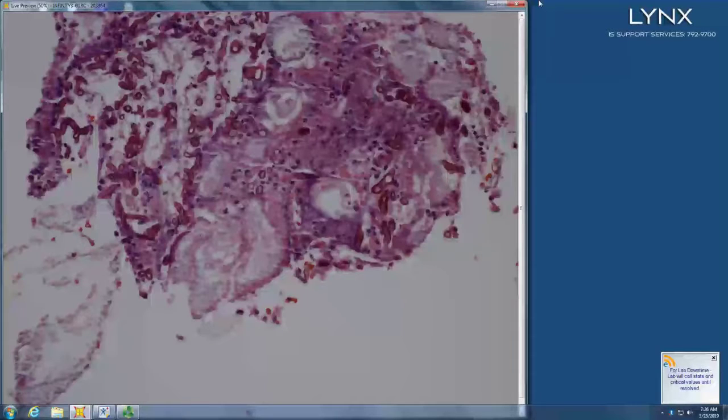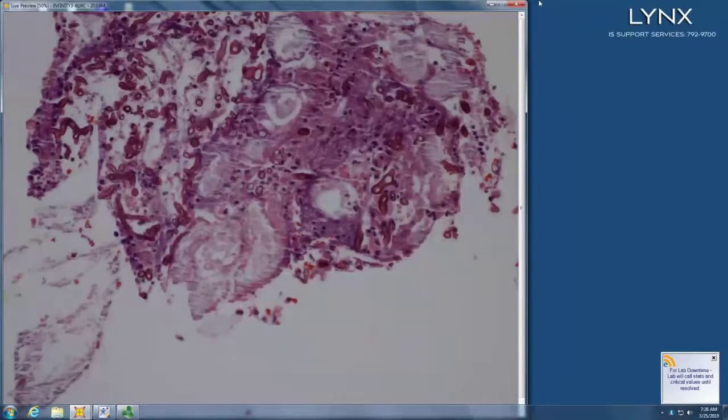So let's take a little closer look. Oh, yeah. Not hard to find, right? But yeah, a little hard to find. You might struggle, but at scan, it's so characteristic for pancreatic that people have cognitive blindness, right? You see the answer. Your brain doesn't necessarily process beyond the first obvious answer, right?